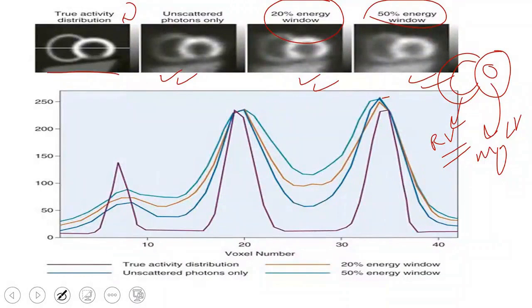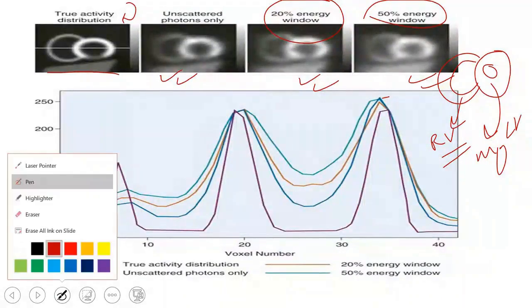But the idea is that I will place a material in the phantom and see the same activity that is present. The activity remains the same. All that was done was to increase the window and observe the effect on image quality. Therefore, increasing the window or energy window will reduce the contrast present in the image.